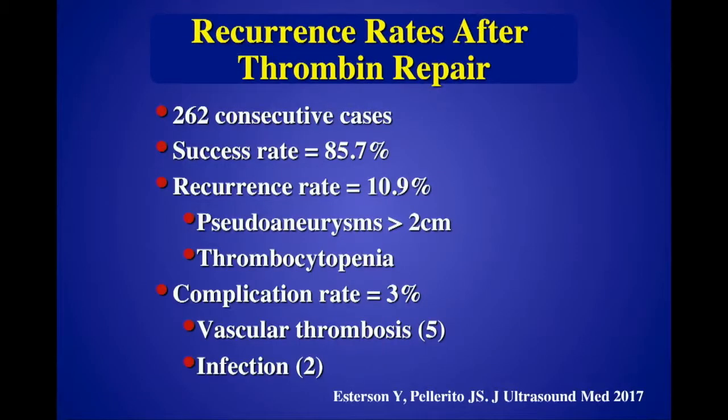This is our series that we published this year looking at recurrence rates, because there's nothing in the literature to say how often these things come back. We looked at 262 consecutive cases. Our overall success rate for thrombin repair was 86%, and our recurrence rate was almost 11%.